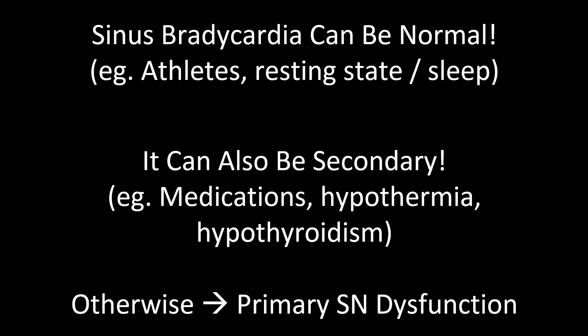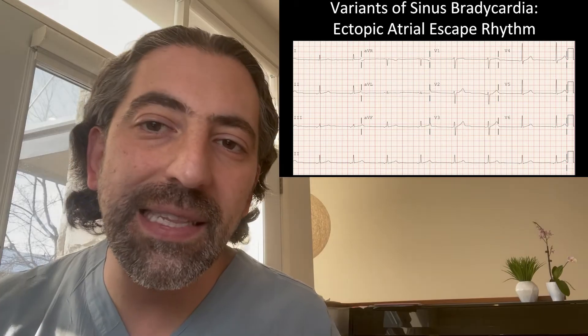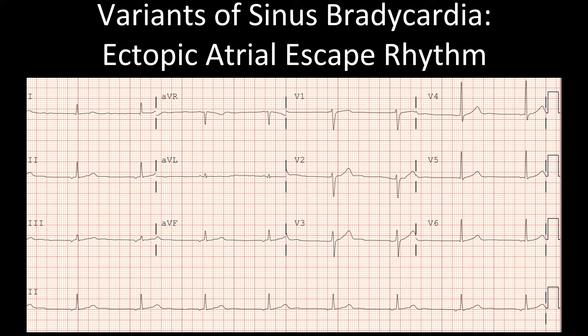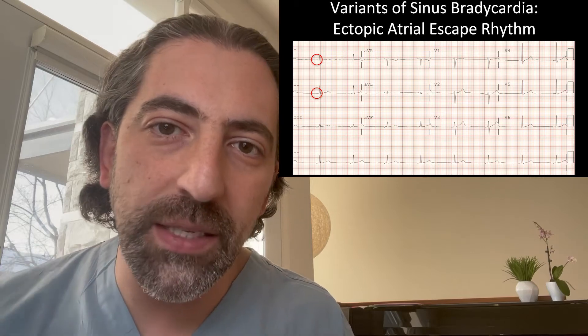It's important to talk about the variants of sinus bradycardia. When the sinus node slows down, other parts of the conduction system may take over — either a different focus within the atria or the AV node itself. When a different focus within the atria takes over, you'll see a P-wave of a different morphology than a normal sinus P-wave. For example, this is a case where the patient is bradycardic, but instead of sinus bradycardia, we see an ectopic atrial escape rhythm. We know it's a different focus because the P-wave is flat in lead 1 and negative in lead 2, meaning it must be coming from somewhere other than the normal sinoatrial node, which is in the top right of the heart.